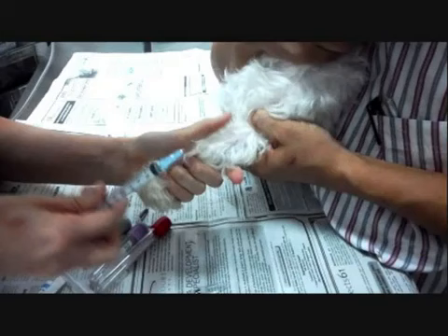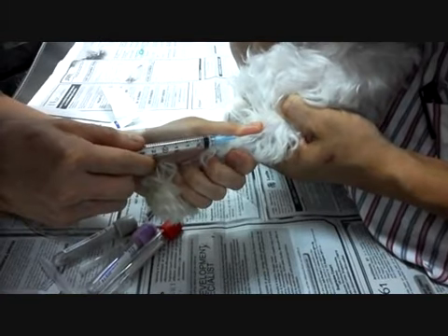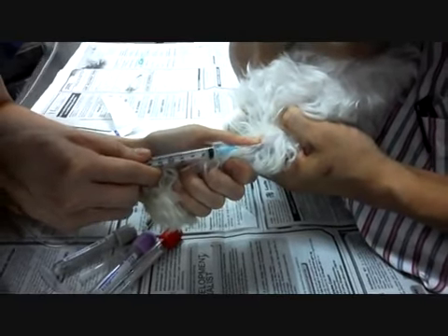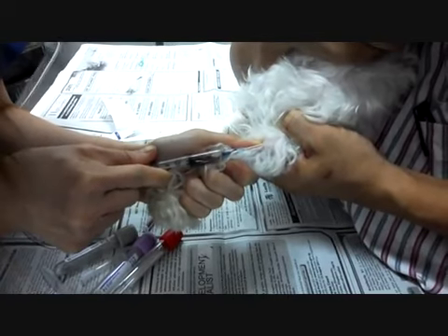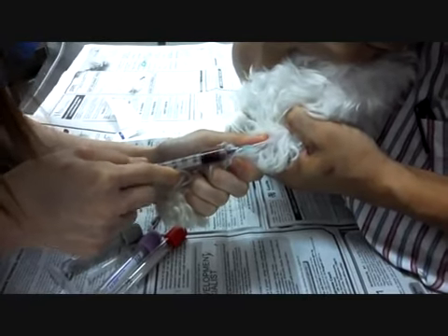Firstly, we did a blood collection so that we could send the blood for the test to show for any abnormalities. As you can see from the picture, the dog is firmly restrained by the veterinary technician on your right. He holds the dog close to his body and extends the front paw. In this case, blood is withdrawn from the cephalic vein found on the medial aspect of both the left and right front limbs. Prior to withdrawal, alcohol can be poured over the limb to allow for easier detection of the vein.